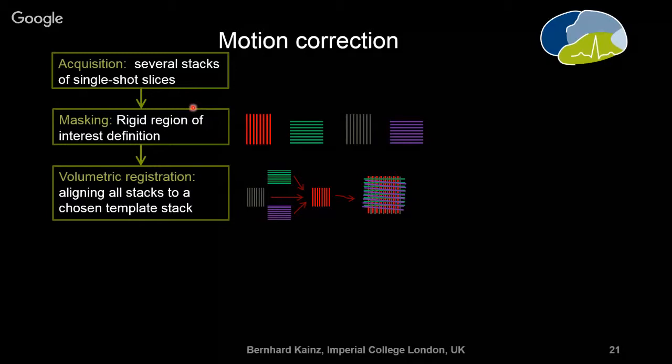So you actually have to select first one of these regions to fulfill a few assumptions which are required later. But despite this, let's say we have a generous identification of the brain. We start first by just aligning the stacks.